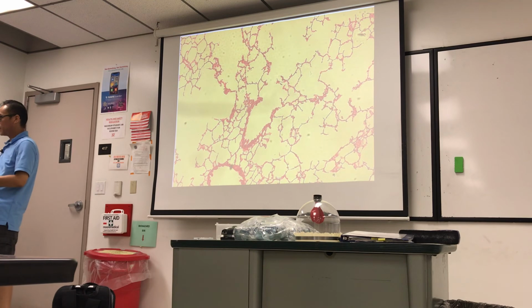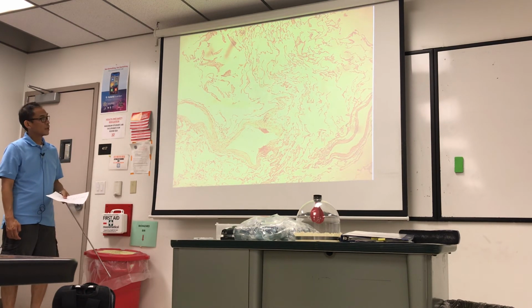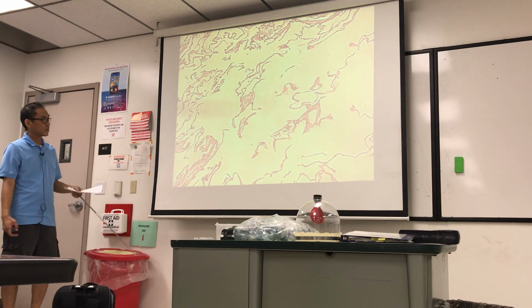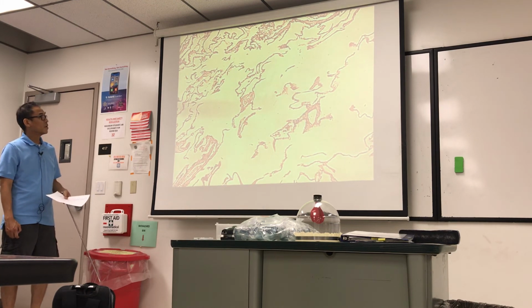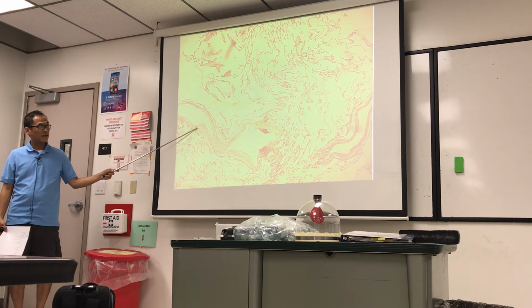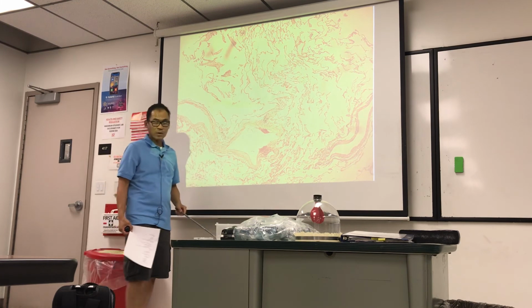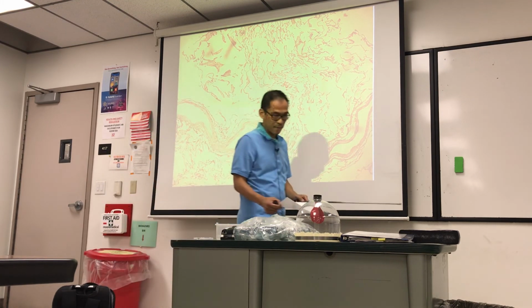Now to get to the diseased lung, under a low magnification, this is emphysema lung. Here it is under a higher magnification. We've got not much to see there, just fewer, larger alveoli. So again, this is emphysema lung. Fewer, larger alveoli. We looked at that before.